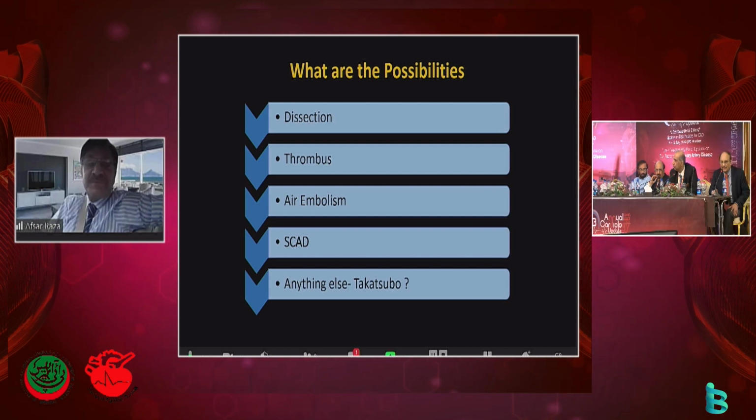It was reopened on its own. With hand injection, it just cleared on its own, without therapy. Did the patient have an enzyme rise? Yes, there was a troponin rise, 10,000 times, but the echo is normal.